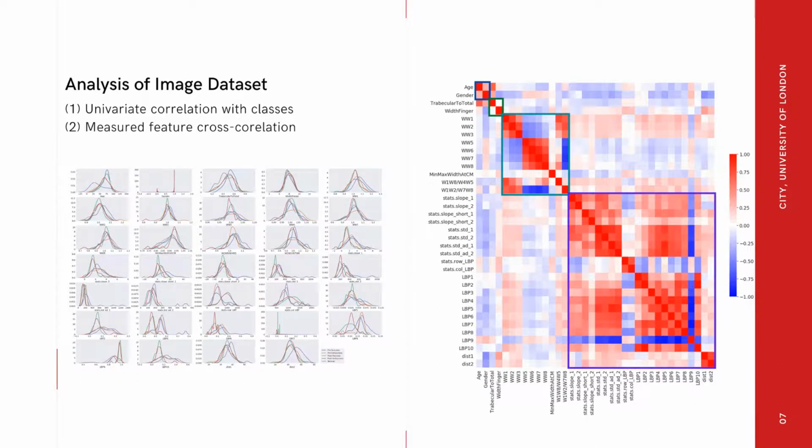Among the features, some of them, such as the local binary patterns, are more capable of separation between classes on their own. In addition, in the cross correlation plot on the right, where I box out the 4 feature groups, it can be observed that intra-group cross correlation is high, while intergroup is relatively low. This will be very useful in subsequent work to identify the important feature groups in classification during future investigation.